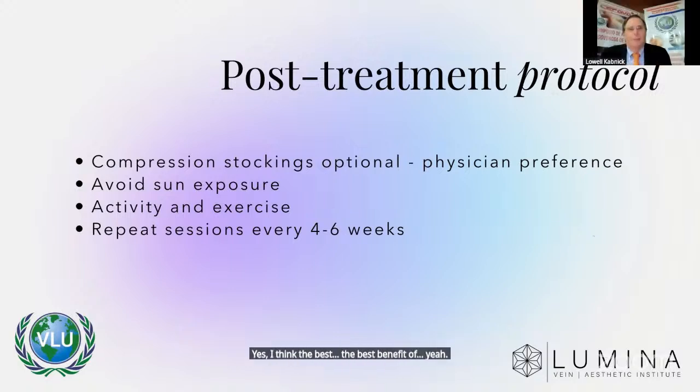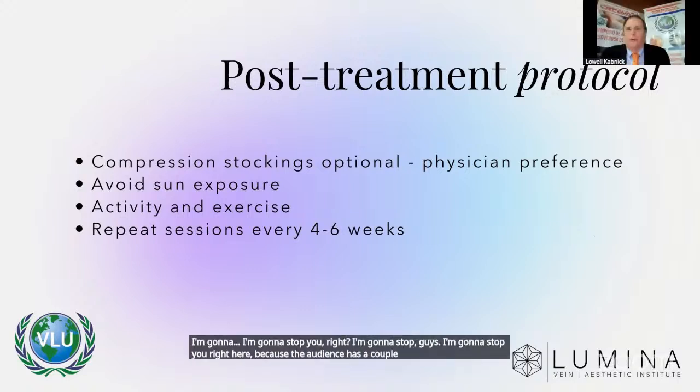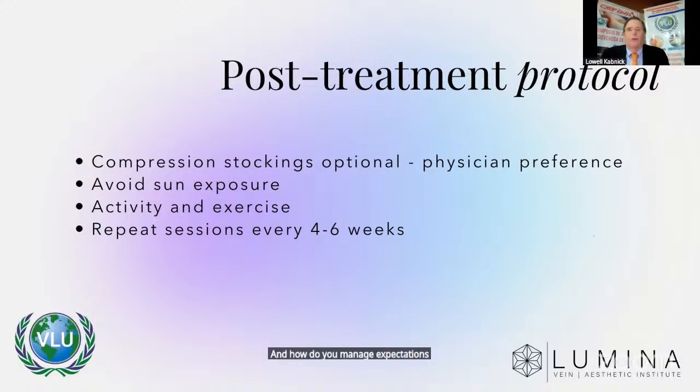Guys, I'm going to stop you right here because the audience has a couple of questions. The first one, please answer these very quickly. In your experience, what key factors most influence patient satisfaction after cosmetic sclerotherapy, and how do you manage expectations regarding long-term results? This is from Omar Esponda.